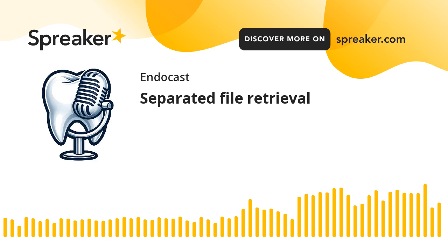And here, actually, that worsens the situation because with perforation, we have an artificial communication with the root, with the supporting structure. However, if we manage to retrieve the file or bypass the file without this error, you have a good prognosis. But after perforation, prognosis for sure goes down.